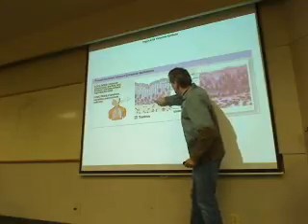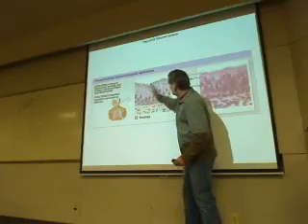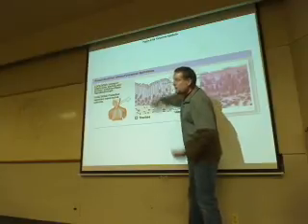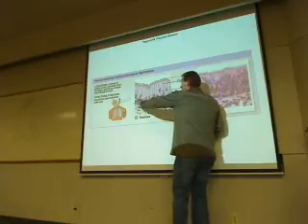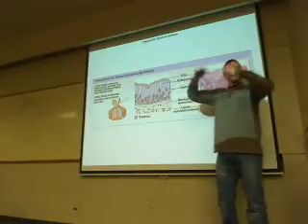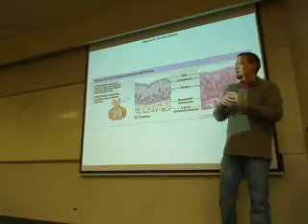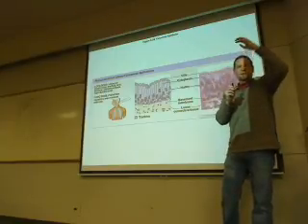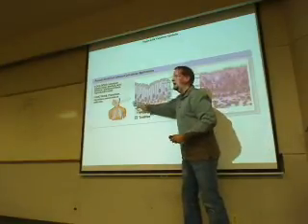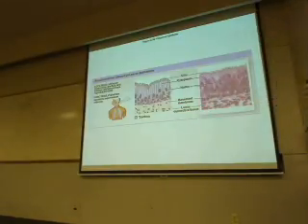And they push on each other to a point where this guy's nucleus goes down and he's actually behind these two cells coming up, and this guy's nucleus gets pushed up, and the bottom of this guy's behind this guy and he's going down, and they get all pushed around. So when we just look at the nuclei, it looks like there's multiple layers of cells because we have multiple layers of nuclei. But the reality is it's one layer of cells, so tightly packed together that some of the nuclei got pushed down and some got pushed up because it's too tight to lay them side by side. Kind of like a log jam. Yeah, exactly.